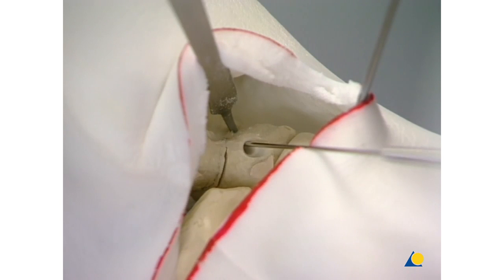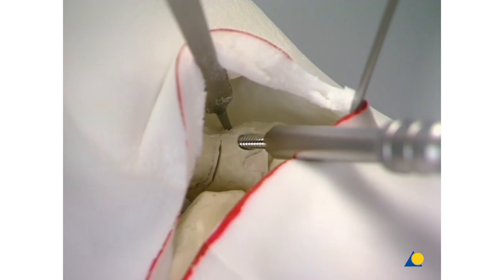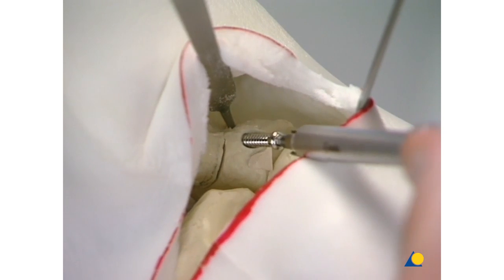The same procedure is performed on the lateral aspect of the talus for a lagged 3.5mm cannulated screw fixation.